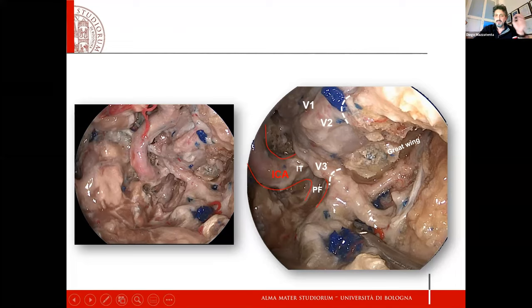of the maxillary sinus. It's important to understand that there are two main techniques, the free hands technique and the two hands technique with the endoscope fixed by the holder, like Professor Schroeder showed before, also in the supraorbital keyhole approach using the endoscopic technique.